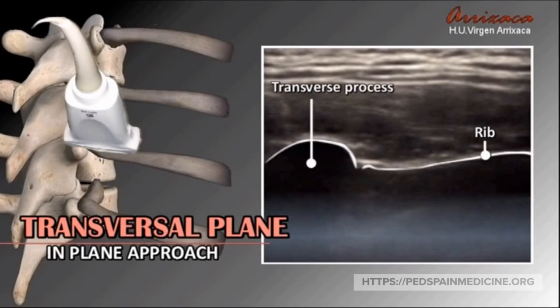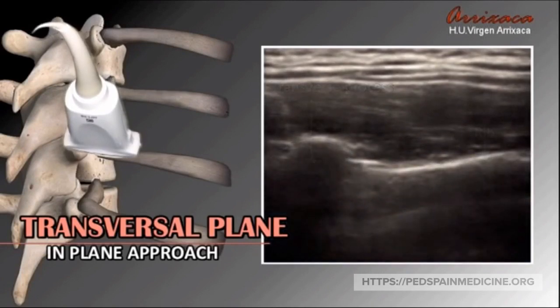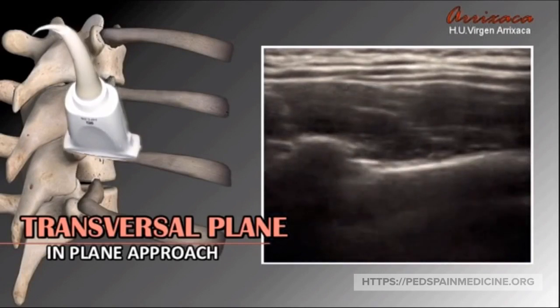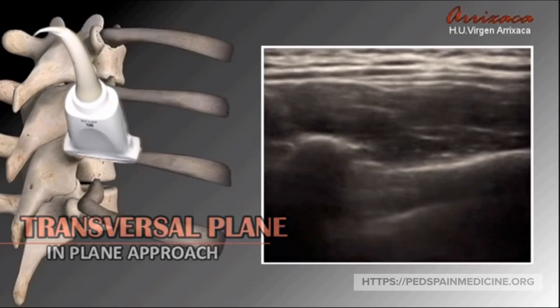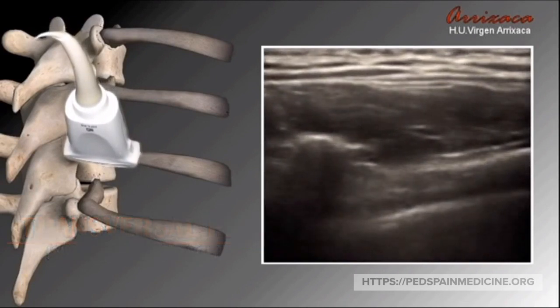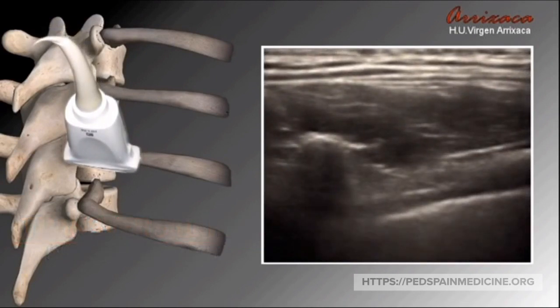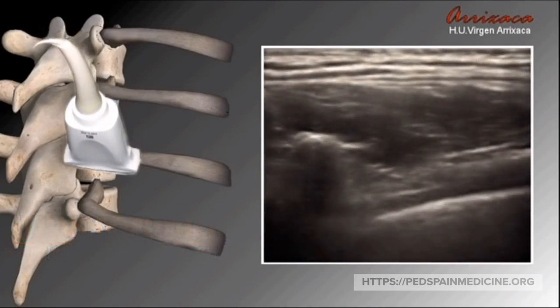The transversal plane approach: using your linear probe, identify your transverse process and rib. Slide your probe downward and find an unobstructed pathway to the paravertebral space.